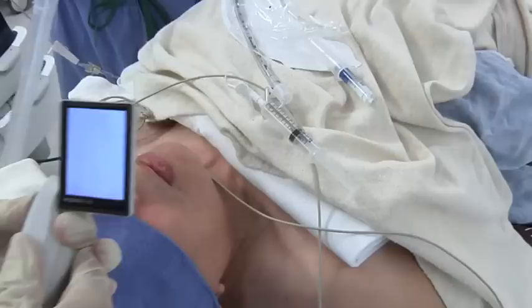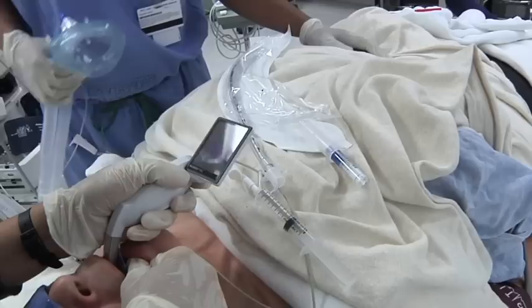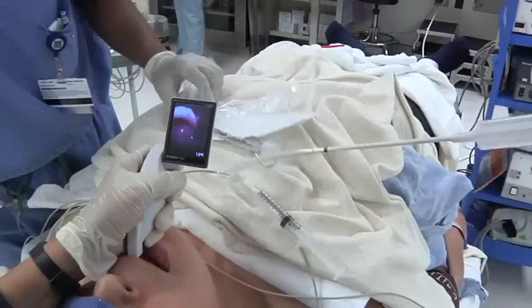Turn it on. Opening his mouth. Wow, it's really deep. There's his glottis — oh yeah, look at that. It's quite deep.